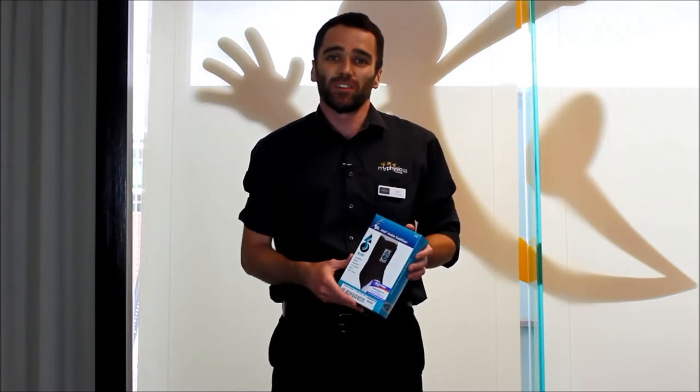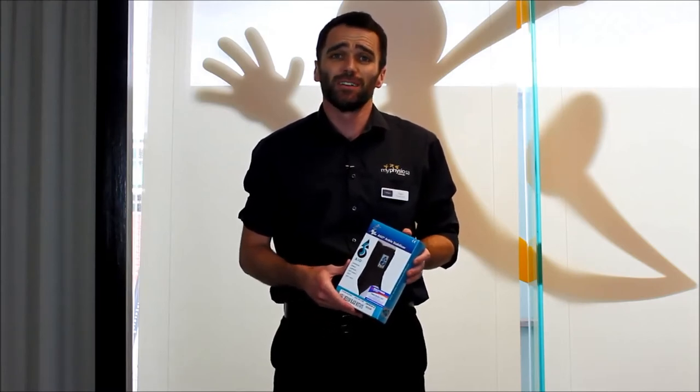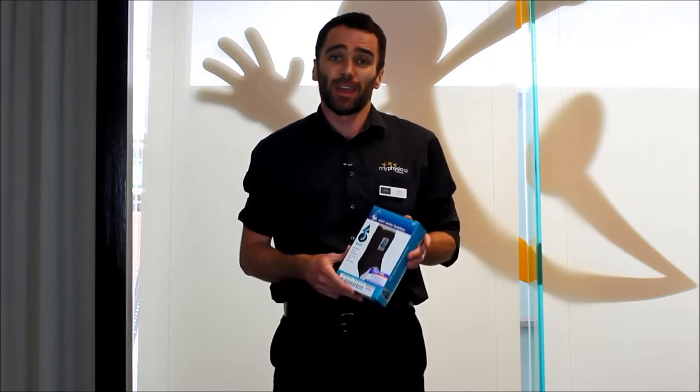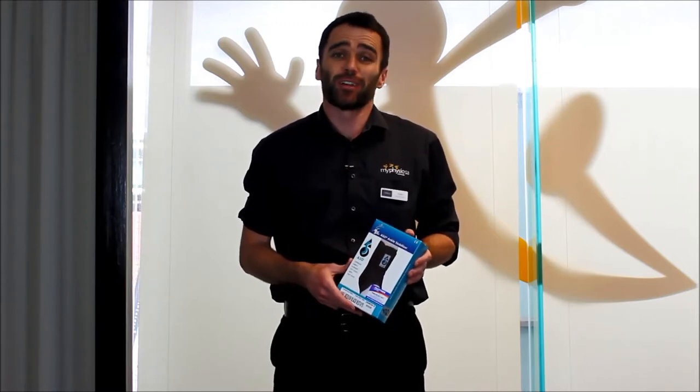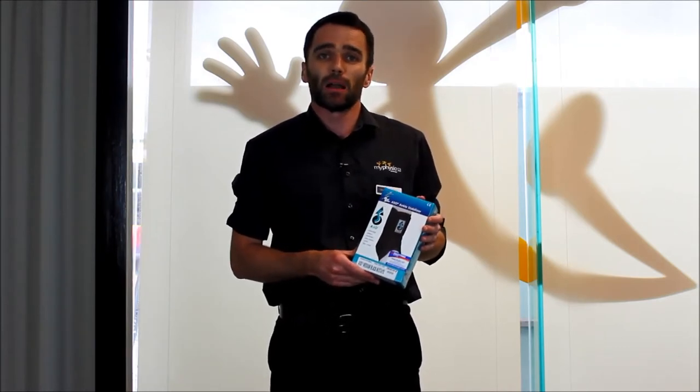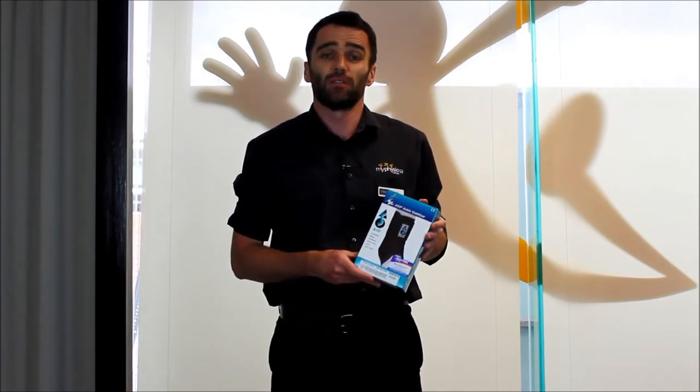Hi, my name's Tom Peters. I'm a physiotherapist at MyPhysioSA here at the North Adelaide Clinic. Today I'd like to talk to you about the ankle brace and how to fit it correctly. This is the most common type of ankle brace that you'll see on the market, and it's the one that we stock here at MyPhysioSA.